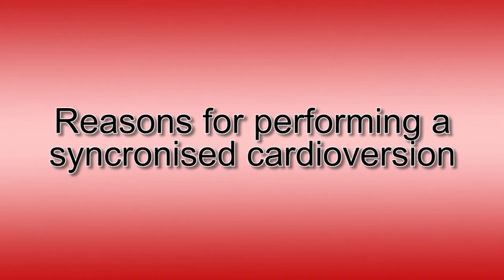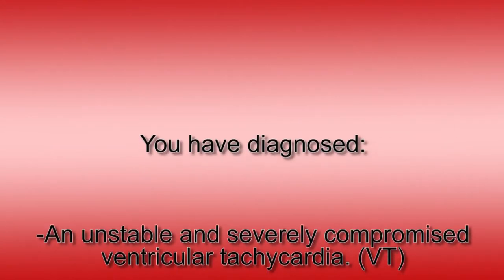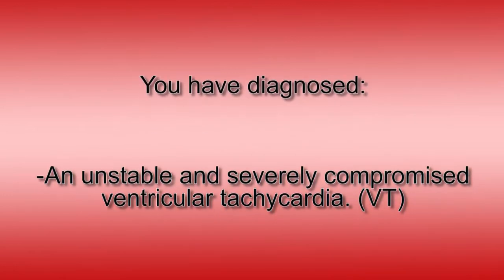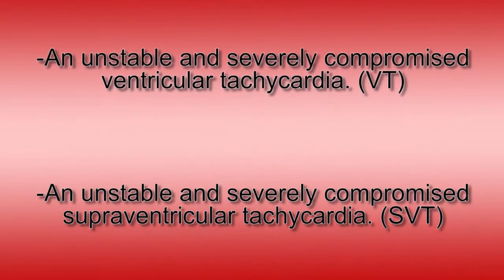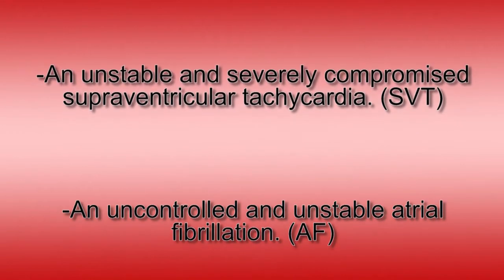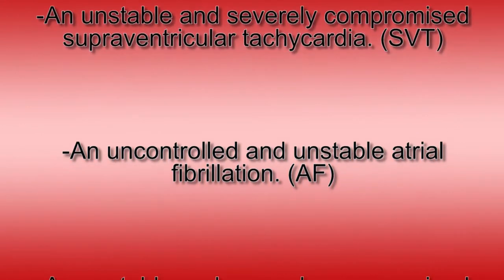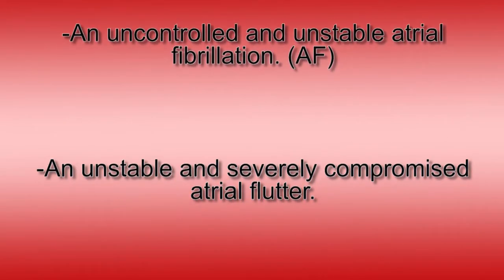This video is broken down into steps so you can review it in your own time and take notes if you need to. Okay, so let's first look at the reasons why you would want to do a synchronised cardioversion in the field. You have diagnosed an unstable and severely compromised conscious ventricular tachycardia. You have diagnosed an unstable and severely compromised supraventricular tachycardia. You have diagnosed an uncontrolled and unstable atrial fibrillation. You have diagnosed an unstable and severely compromised atrial flutter.